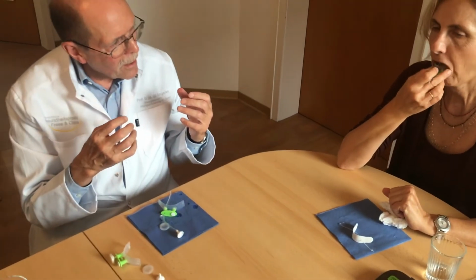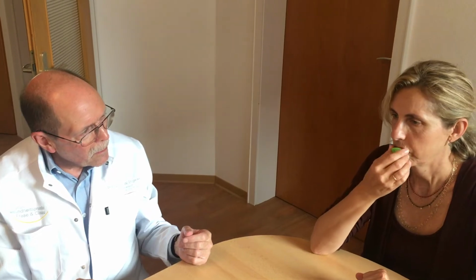Now, would you please try this exercise? Put the device inside, and now without negative pressure, you can pull it against the pressure of the perioral muscles. Please. Did I give you one? Okay. So the same device may be used to strengthen the perioral muscles, but in a different way.